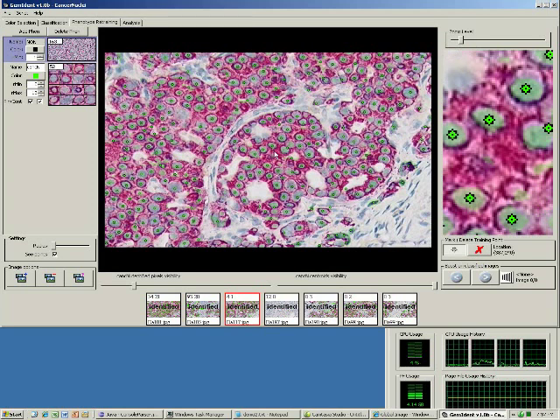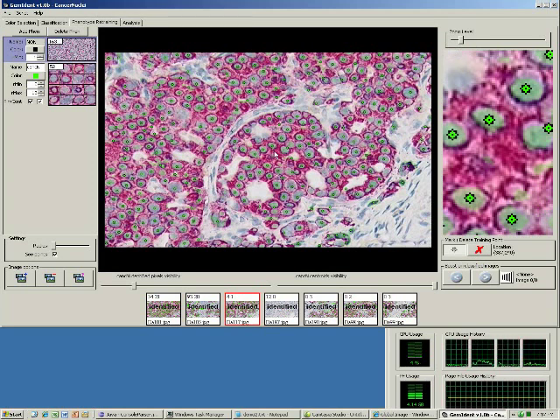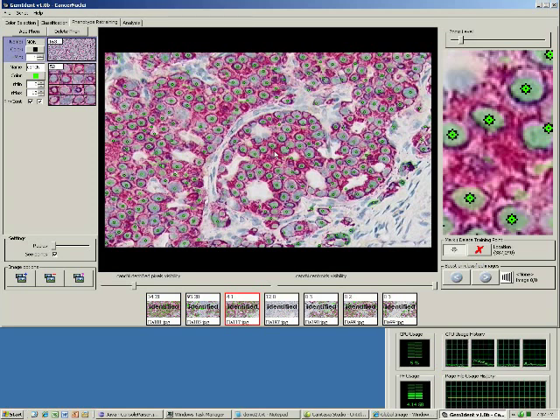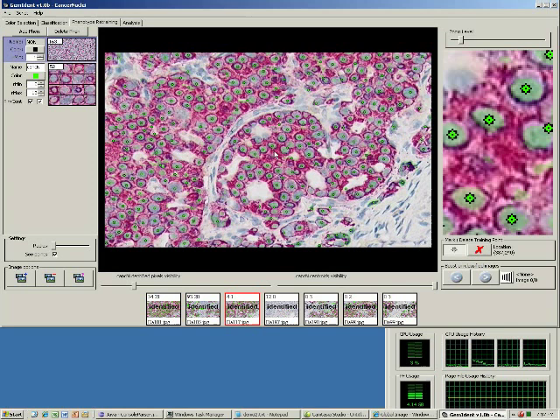A good classification may take many cycles of training, classifying, retraining, reclassifying. It all depends on the application and the accuracy desired. When confident, a full classification of all images in the set can take place.